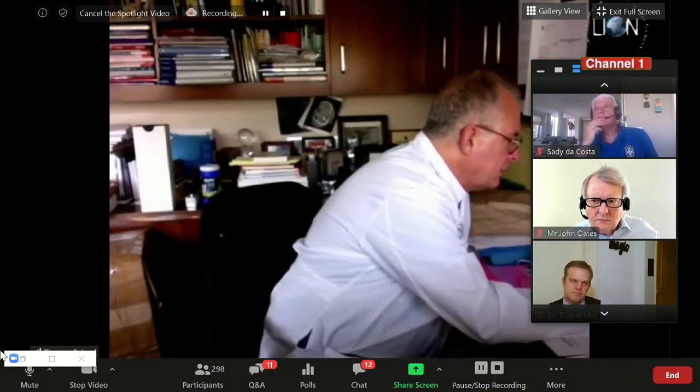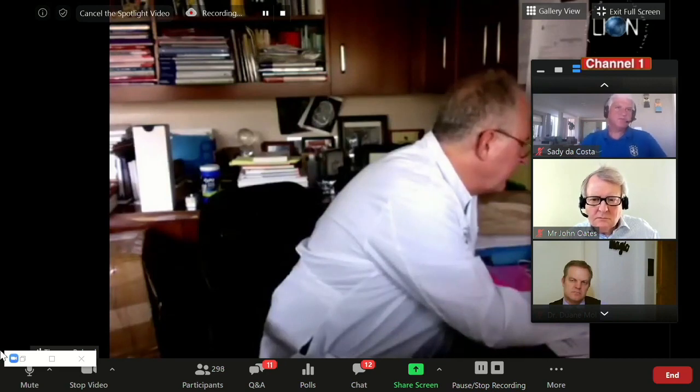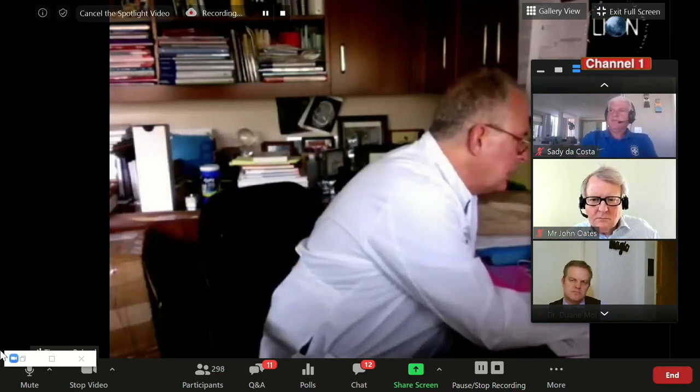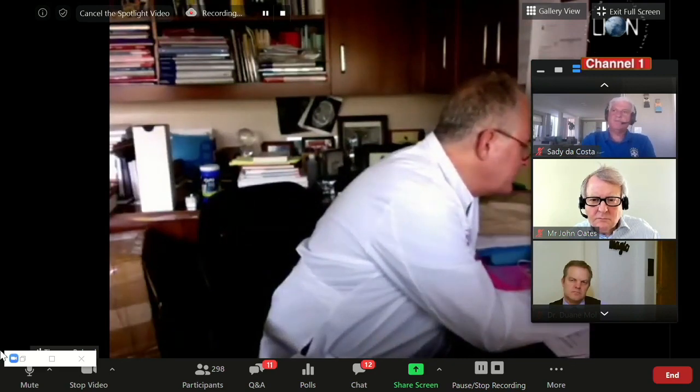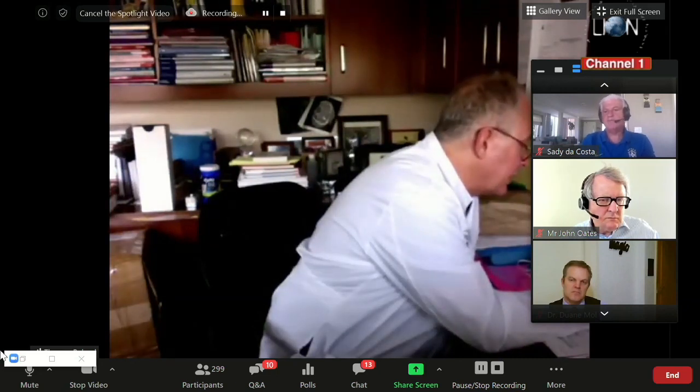Maybe a failed tympanoplasty, maybe a long history of drainage, and the middle ear mucosa doesn't look so healthy, doesn't look like reversible mucosal damage. On two occasions I have seen adenoidectomies gone awry where the scarring around the eustachian tube was complete, so we placed the balloon in the reverse direction through the ear, saw the light, then used a debrider, opened up the torus and put in a stent for six months. The child is actually ventilating his ear now, which is interesting. I wasn't sure that was going to work.